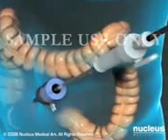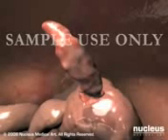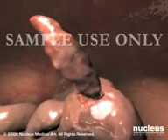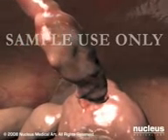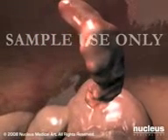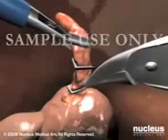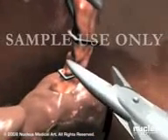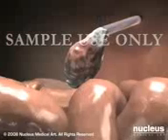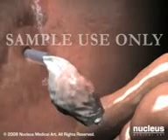Next, your surgeon will insert the laparoscope through the umbilical port. Images from its camera are projected onto a video monitor in the operating room. Your surgeon will carefully examine the inside of your abdomen, confirming that your appendix is red, swollen, and needs removal. At this point, your surgeon will pass surgical instruments through the other 2 ports, grasp the appendix, separate it from the intestine, drop it into a specimen bag, and remove the specimen bag through one of the ports.